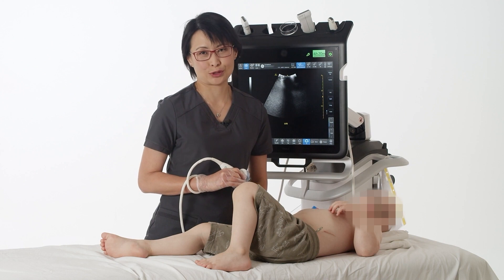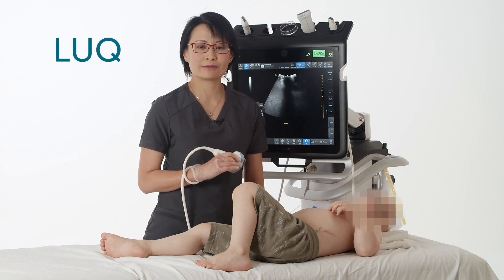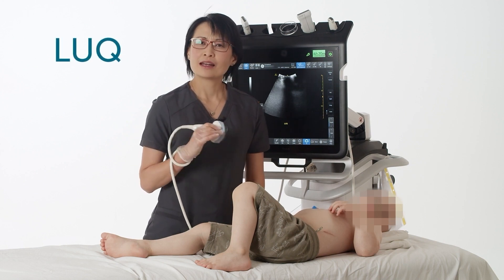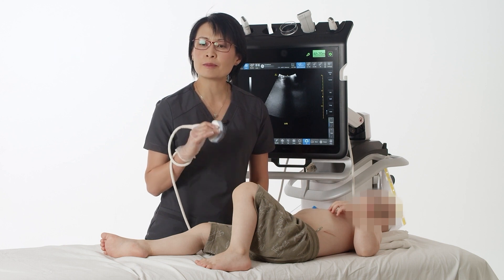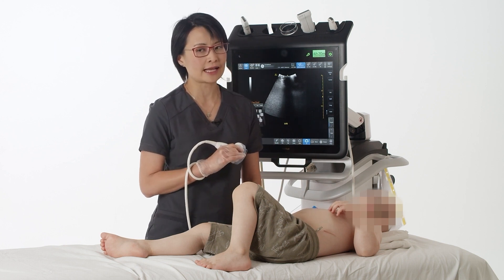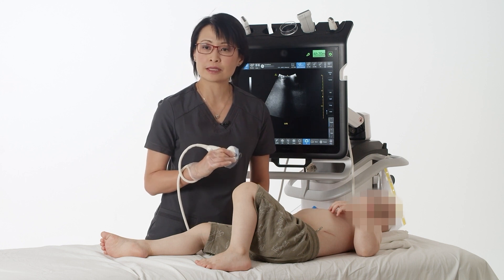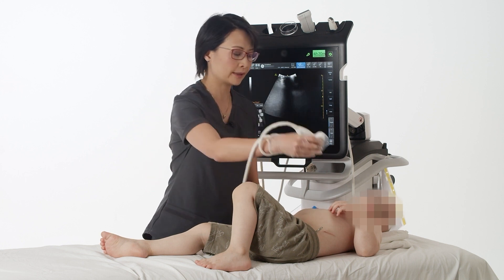Let's go to the scanner. I'm going to show you how to obtain the standard left upper quadrant view. The left upper quadrant view is a little bit more challenging than the other side because the kidney is more posterior and more superior.